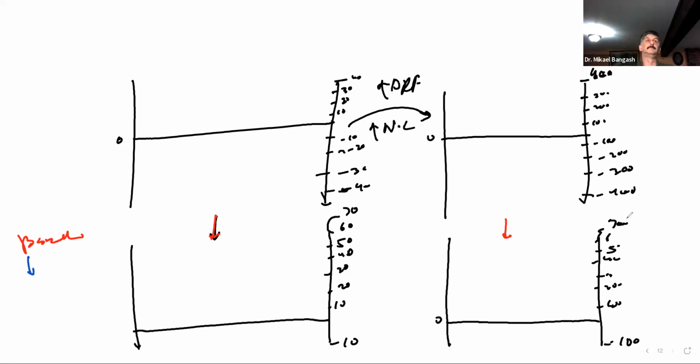Did that make sense? Yes. Okay. So you can increase your scale on the positive side, but there's going to be an equal decrease on the negative side when you do a baseline shift. That doesn't happen when you just increase the scale, because as you increase the scale, they're going to change equally on both sides.